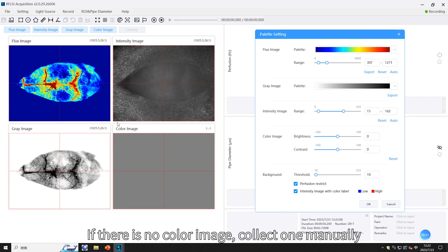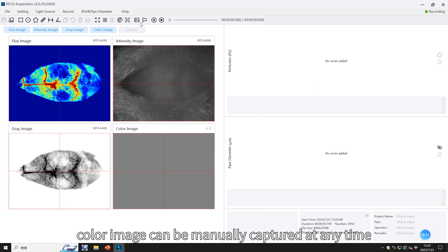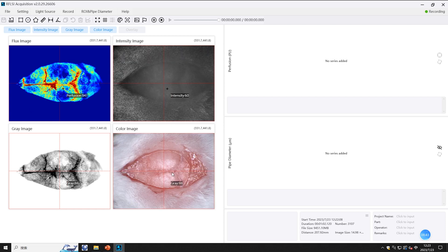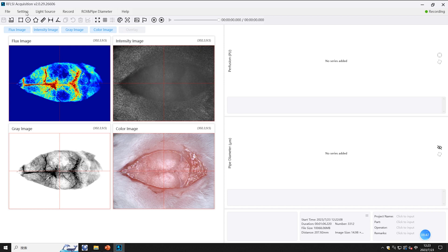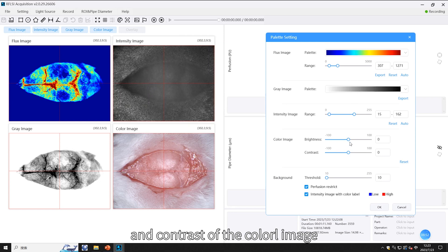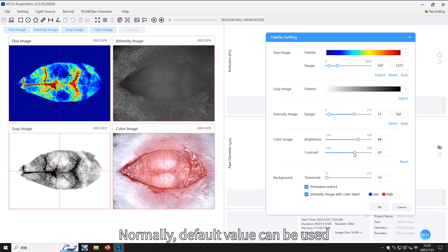If there is no color image, collect one manually. The color image can be manually captured at any time.